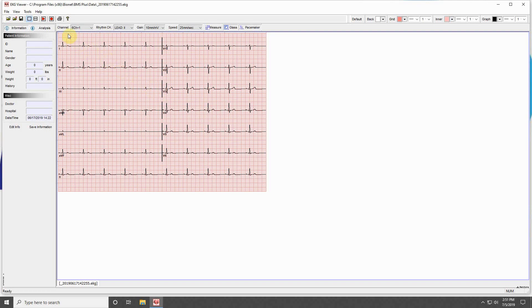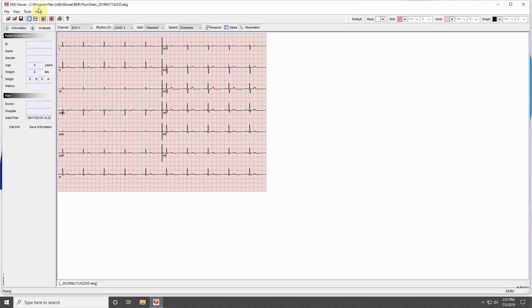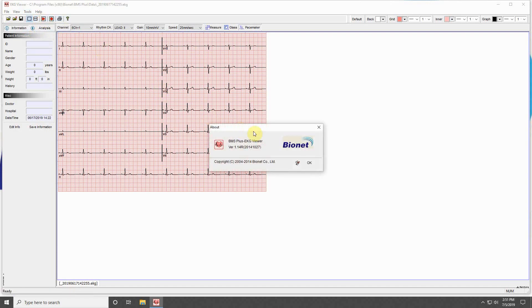The last tool is a toggle, which allows the ECG to display pacemaker detection or not. The last menu is the Help menu, where clicking About will display the current version of your software.